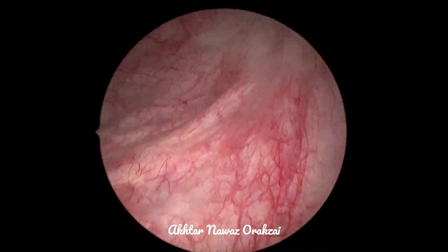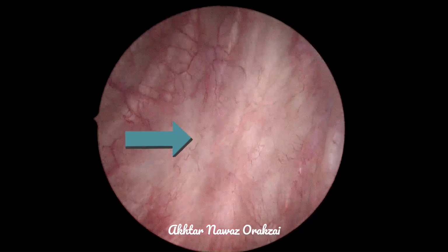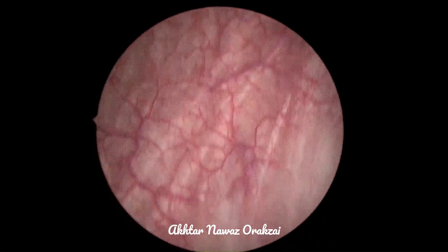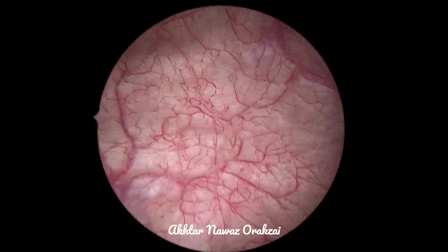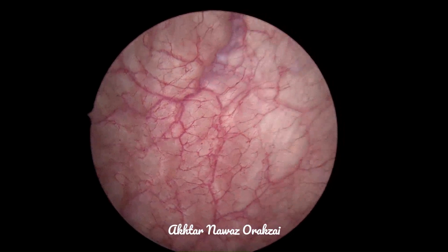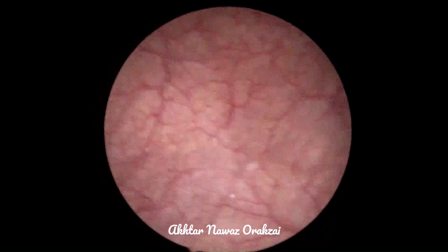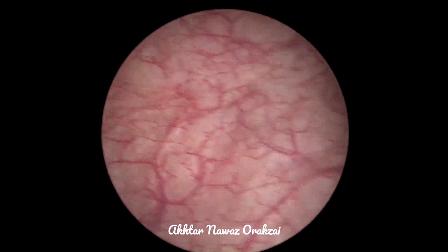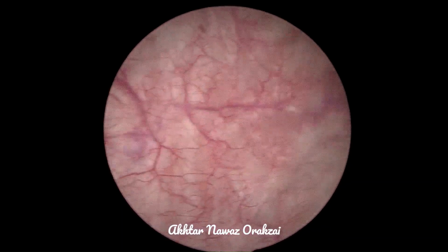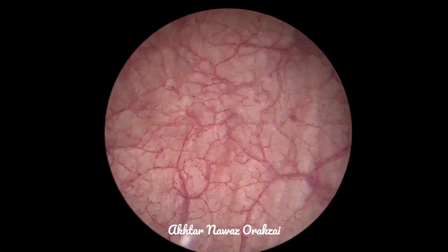Now we are coming to the left lateral wall, as we saw something suspicious, so we came near. This is the resected area, the arrow pointing. You can see that we are going up and then coming down and then moving inside as well. So there is a lot of cystitis. You can see that this vessel is going, and I always follow these vessels because they are feeding some tumor or some inflammation. This is the resected area from the previous side. So there is no recurrence on the previously resected areas.